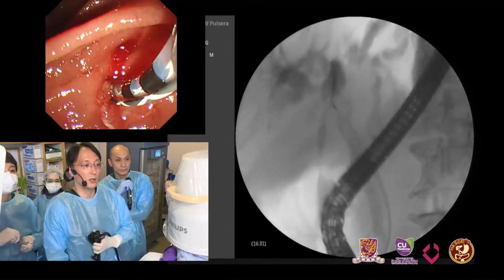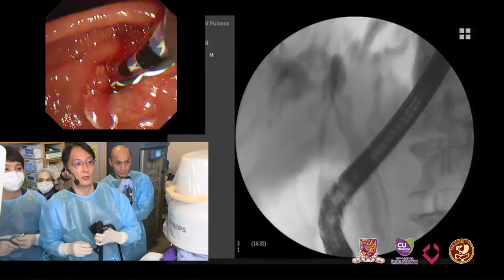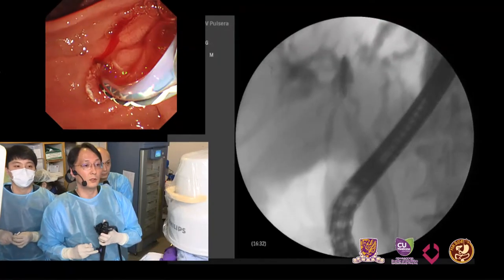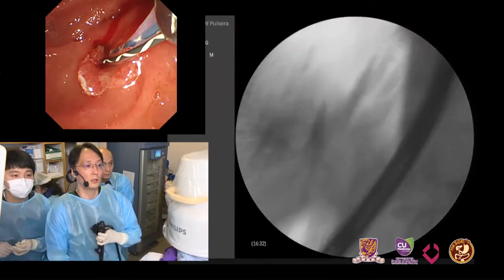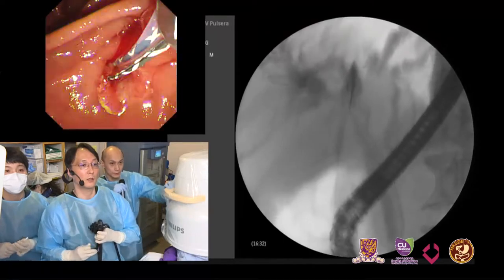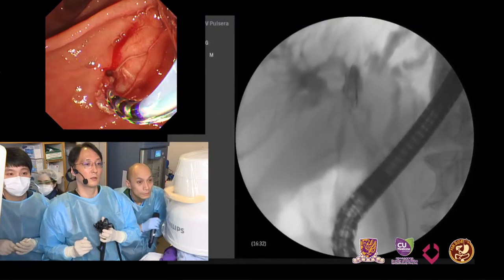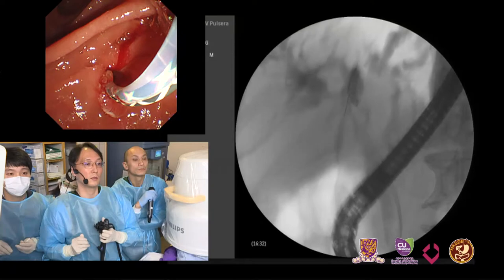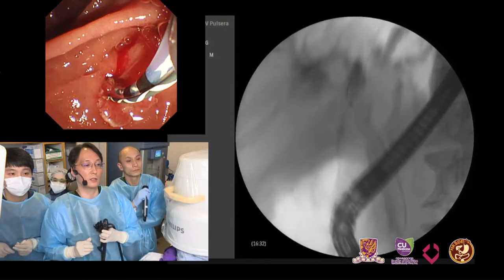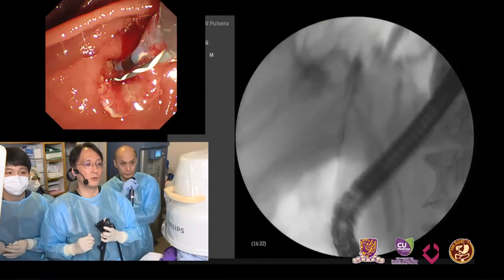Okay. So I try the right posterior first, then we try the right anterior duct second. I think it's ACM. Needle, wire. Wire, please. More. Has it moved? Sometimes a looping technique may be useful. It's out. Okay, it's better. Then I try the right posterior first one.